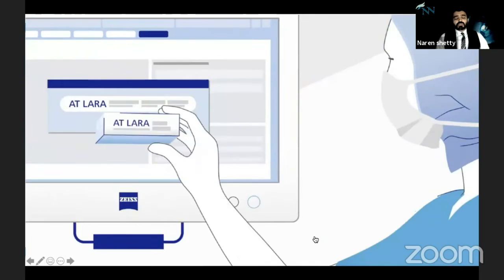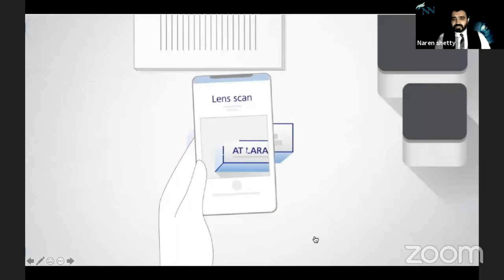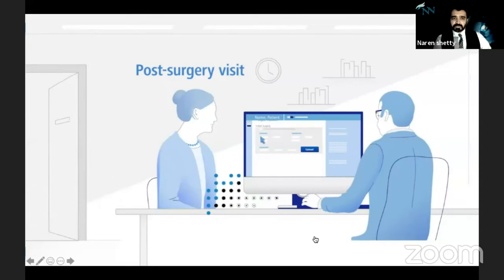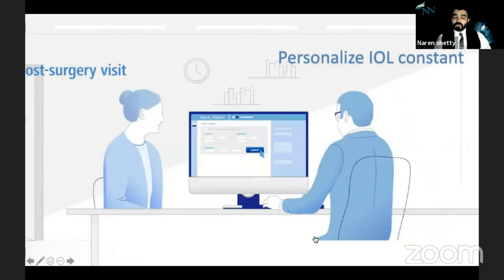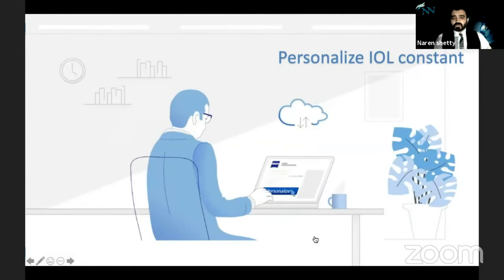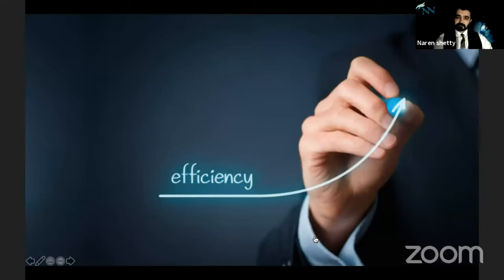Now, in the OR, let's say you have decided the lens, you have taken the package of the IOL, and you just need to scan the IOL, and this data is uploaded onto the EQ Workplace. Now, in the post-surgery visit, you can personalize the IOL constant. I feel this is a beautiful feature where, for each doctor or each IOL being used, you can personalize the constant and really tighten your results.